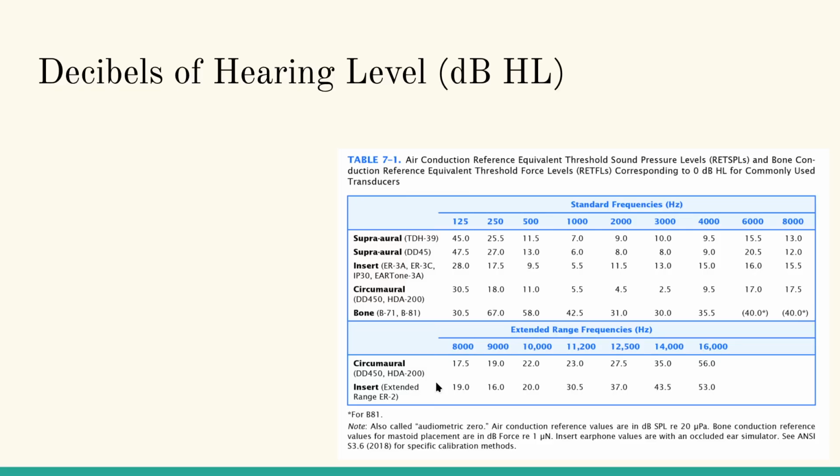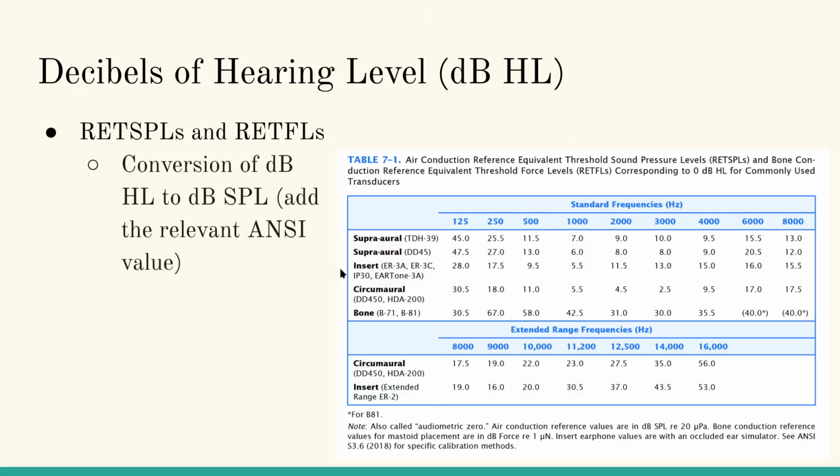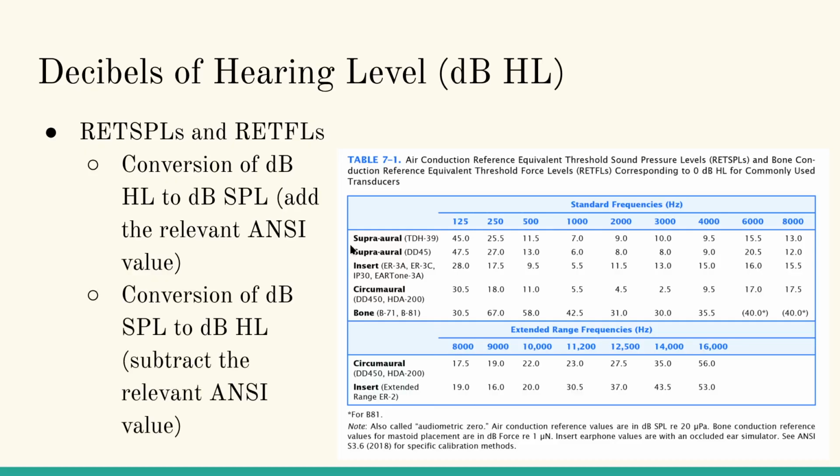dB SPL is referenced to 20 micropascals. I think you learned that in acoustics class, that dB SPL has an inherent reference of 20 micropascals. Bone conduction has an inherent reference of 1 micronewton. So with RETSPLs and RETFLs, for conversion of dB HL to SPL, we simply add the reference ANSI value, and going from SPL to HL, we subtract the relevant ANSI value.